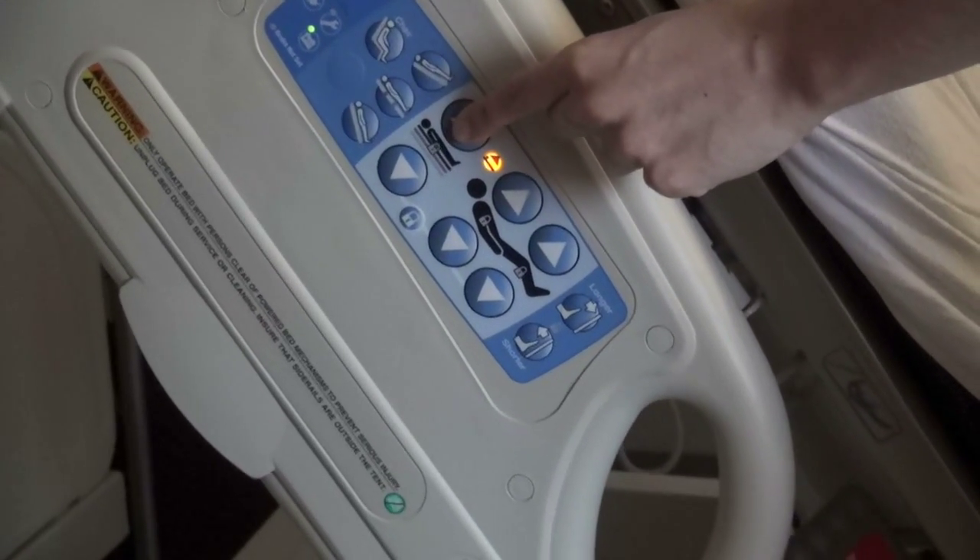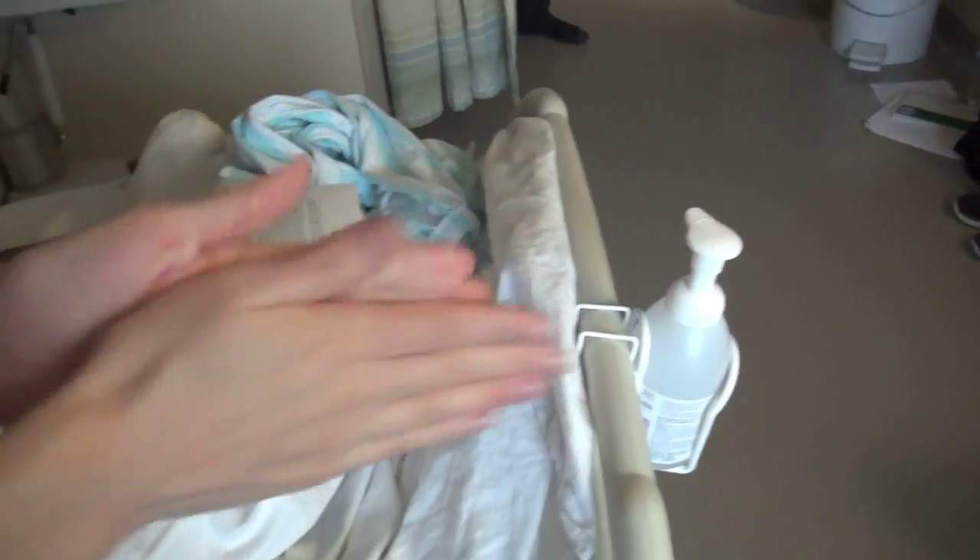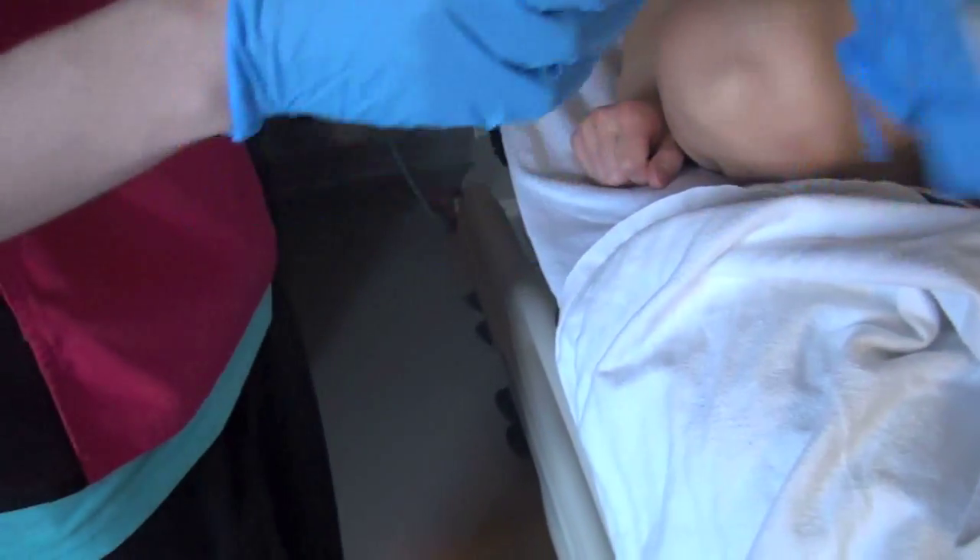Raise the bed to hip level to promote proper body mechanics. Lower the bedside rail. Perform hand hygiene prior to collecting the blood and put on gloves.